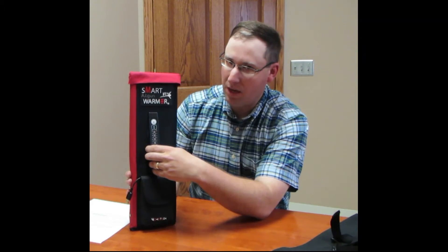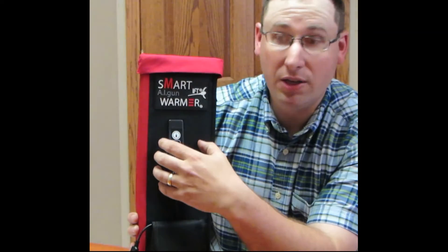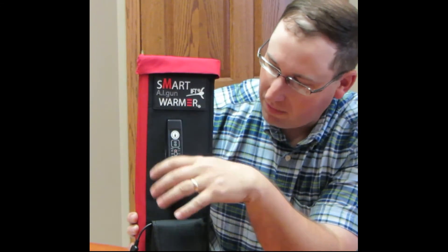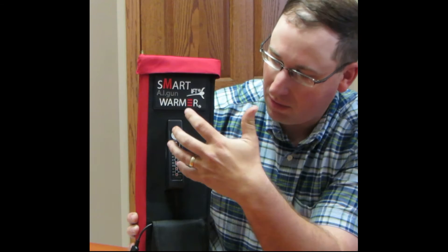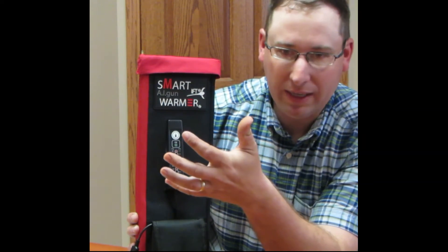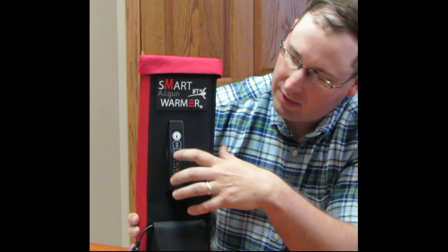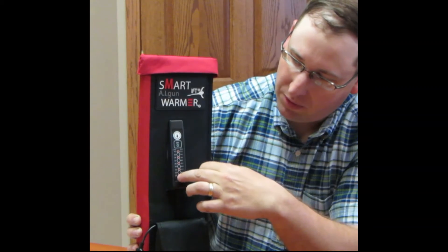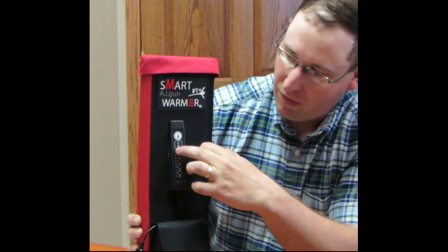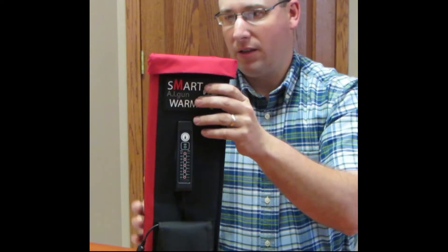The control system is much like the pre-adjustable thaw unit that IFT makes — same configuration. The system calibrates itself and all the lights come on. The green light will indicate when it's reached the preset temperature. You can then adjust the temperature up and down by pushing the little thermometer icon, and the temperature indicator will move up and down accordingly based on what temperature you're wanting to select.